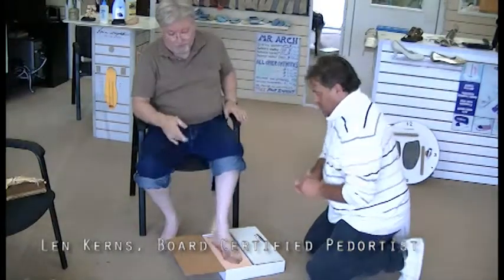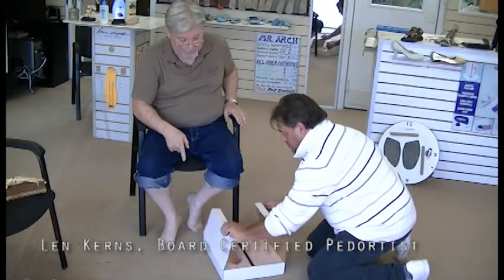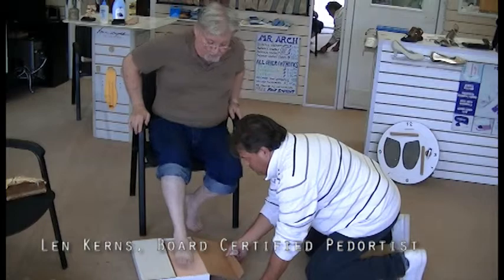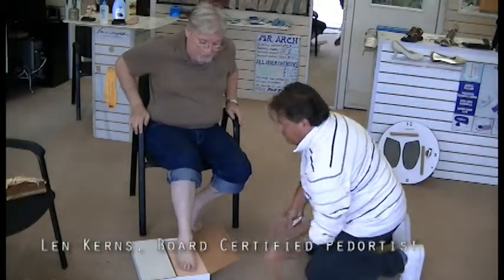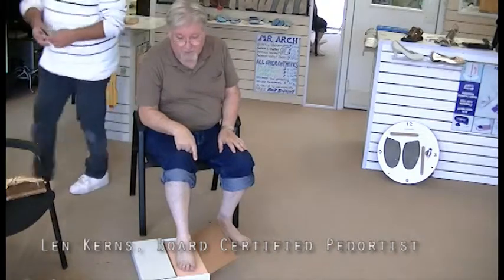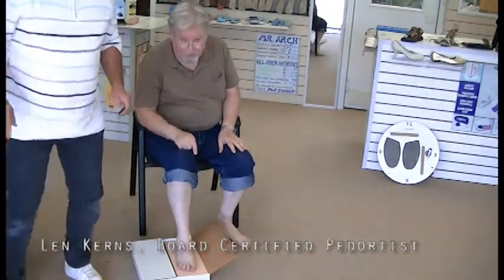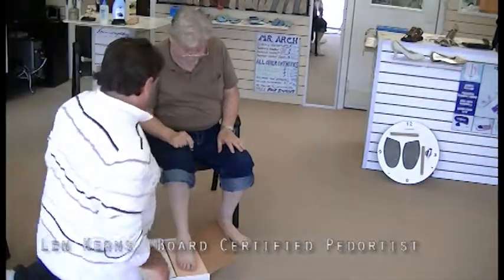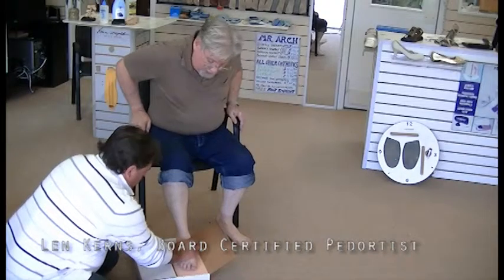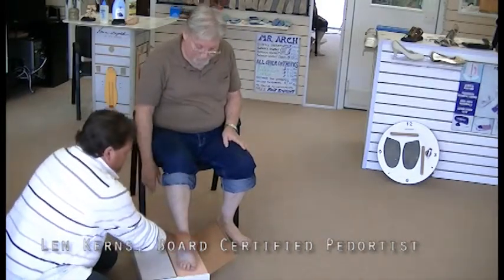So at this point, Mark's going to close the lid. Just push it over so the lid's between the legs so he can turn it again. I'm resting my foot now, and he's going to turn this box so it pivots on the heel. That's the secret of the rotating machine. And put me in neutral again. And he's also lining me up 90 degrees to the box. If you have the leg, right here is 90 degrees.